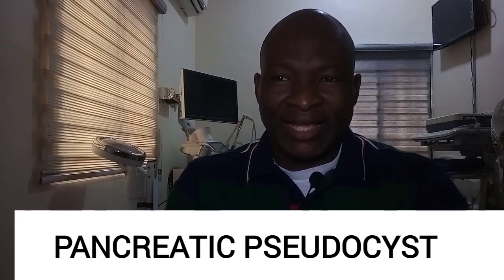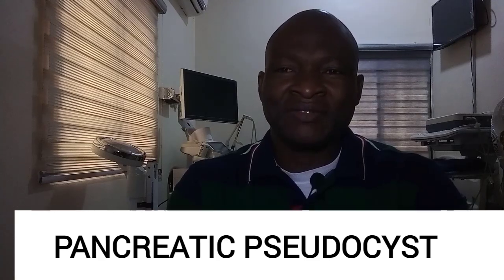Let's look at pancreatic pseudocysts. Now, pancreatitis may result in the rupture of the pancreatic gland with liberation of pancreatic enzymes into the anterior pararenal spaces. These enzymes may digest surrounding tissues and blood vessel walls and will form a free unencapsulated fluid collection around the peripancreatic region.